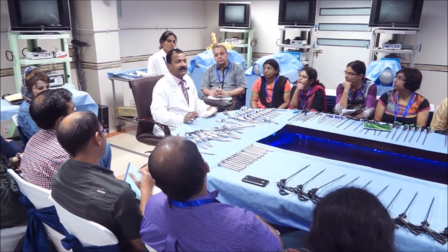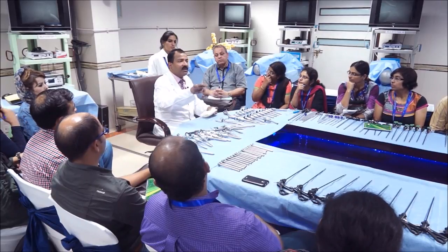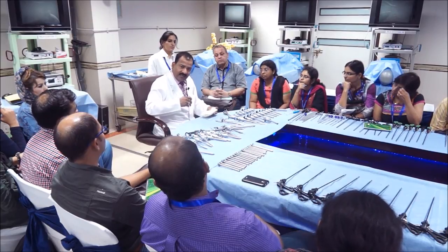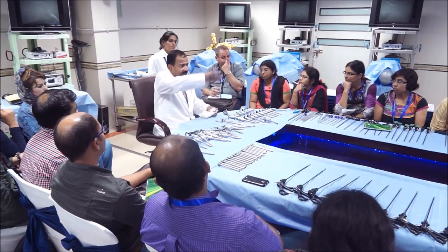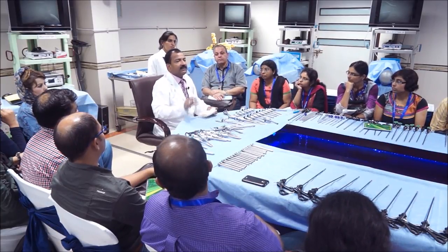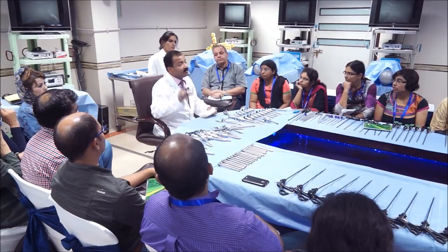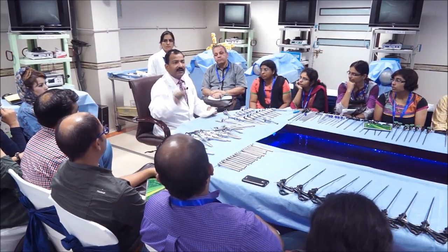The reason being, it is a central location, making access to all the quadrants of the abdominal cavity easy. You can go right iliac fossa, left iliac fossa, upper hypochondrium, everywhere. Central location can give you access to all the quadrants. The second advantage is, it is the thinnest part of the abdominal wall, because at the level of the umbilicus, the inferior and anterior and posterior rectus sheaths are fused together, which is making it thinner.